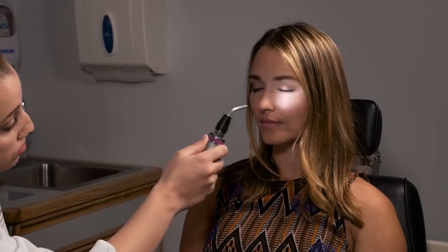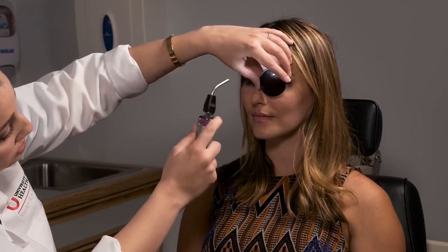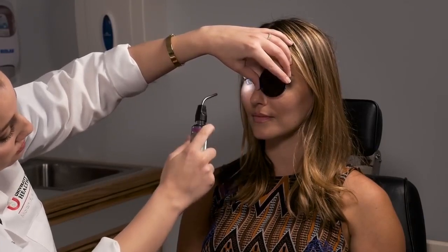And then you do the swinging light test where you go back and forth between the 2 pupils. An afferent pupillary defect is present if the pupil dilates when the light reaches it again in the swinging light test. So for demonstration purposes, I'm going to try to induce an afferent pupillary defect on the left side. So for this instance, I'm going to hold the neutral density filter over the left eye. The left eye will perceive less light, and the pupil should dilate on the swinging light test. So if you'll just look straight ahead again for me. This is the swinging light test. Instead of constricting on the left side, the pupil dilates slightly.